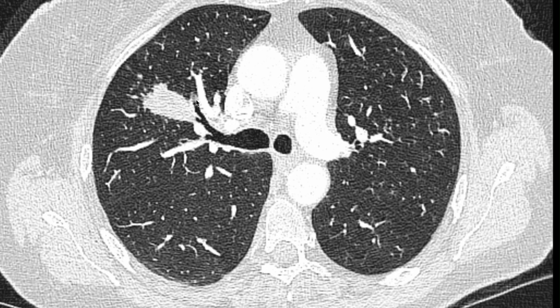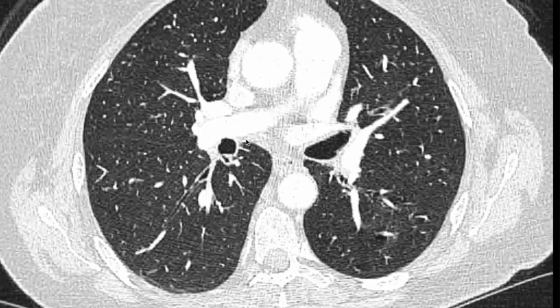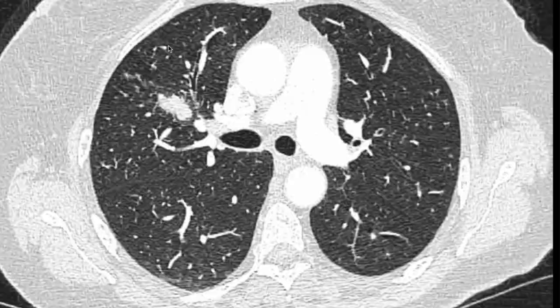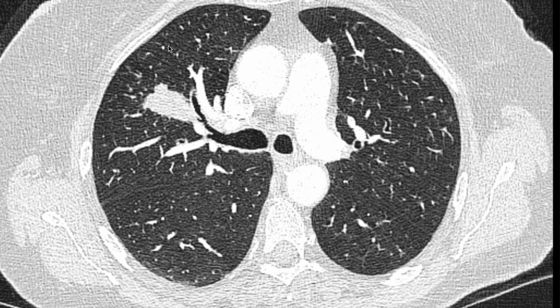The anterior branch here, RB3B, we'll miss it. We'll go out past it into normal lung, so we don't want to take that one. If we go down further, this comes into bronchus intermedius, and the right middle lobe is clearly going underneath it. So it's in the right upper lobe, anterior segment, RB3A, not RB3B.